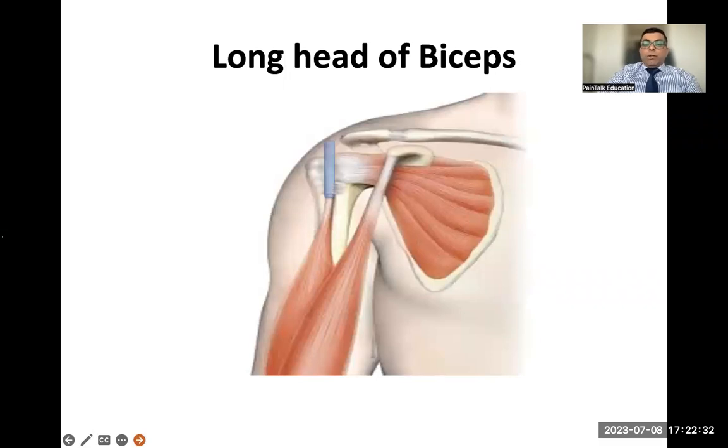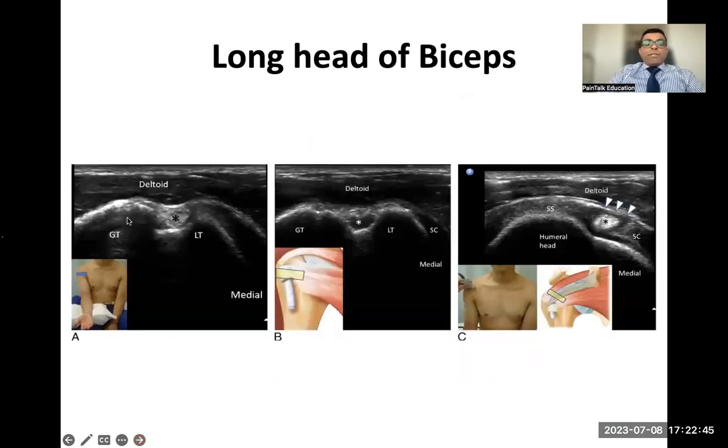You can scan the biceps tendon longitudinally or transversely. In transverse scanning you'll see the greater tuberosity, lesser tuberosity, deltoid muscle superficially, and the long head of biceps sitting in the bicipital groove. This is a highly anisotropic structure — when the ultrasound beam is perpendicular to the tendon it's bright, but if not perpendicular it looks dark. Always scan in both transverse and longitudinal views. As with X-rays, one view is no view.